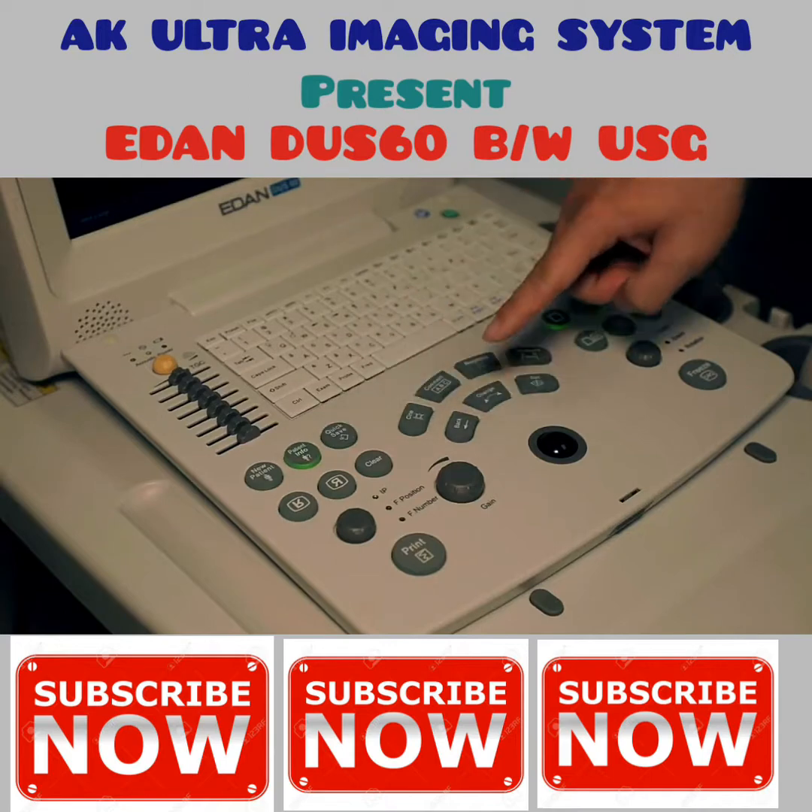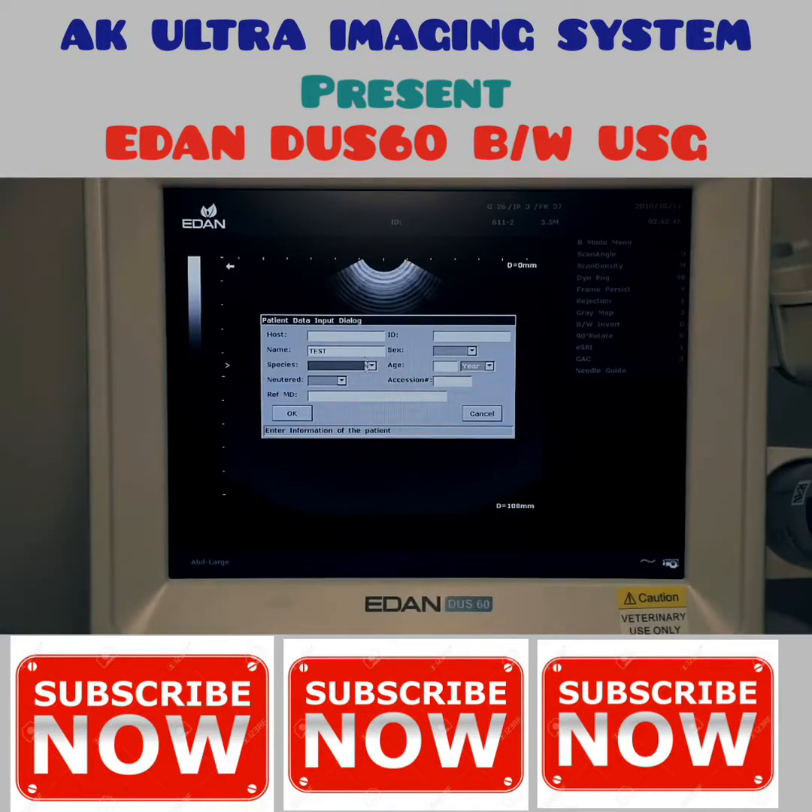Press the patient information key and input animal type, sex, age, and name. Roll the trackball to select OK and press the set key to confirm.